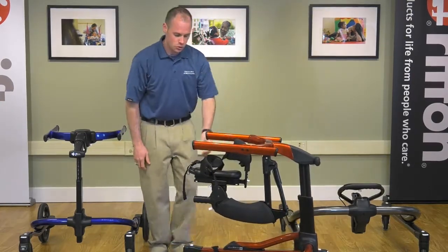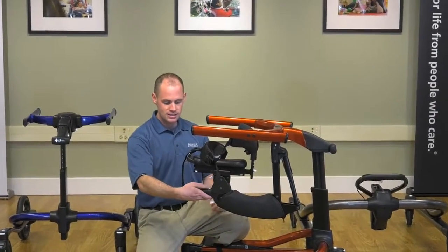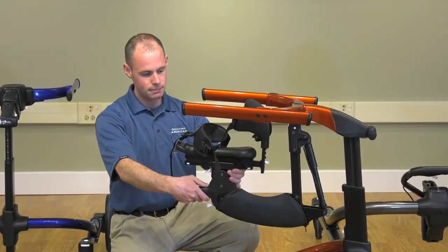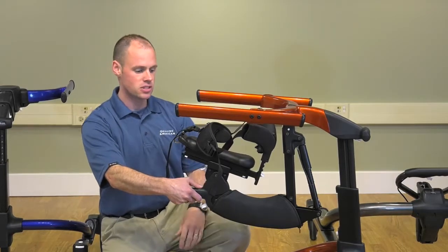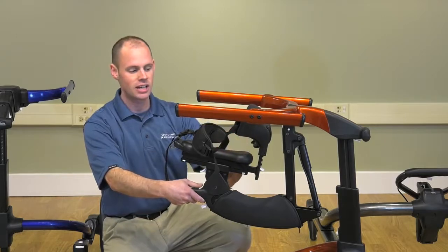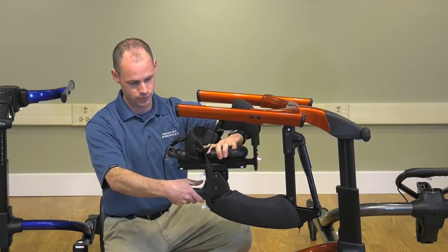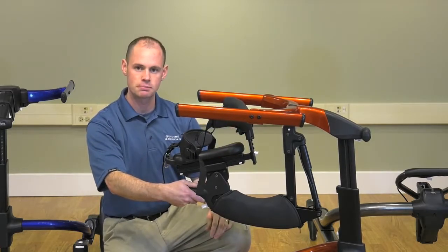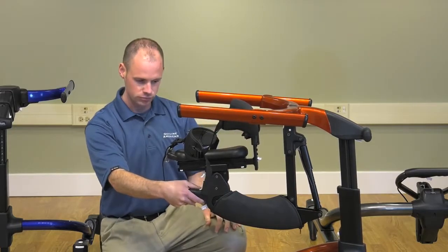The next adjustment we have is the tilt. With your hand in the same place, just push this button on the back of the MPS, and that allows for 5 positions of tilt, 15 degrees forward, 7.5 degrees forward, flat, 7.5 degrees back, and 15 degrees back. So that allows you a nice range of tilt positions.